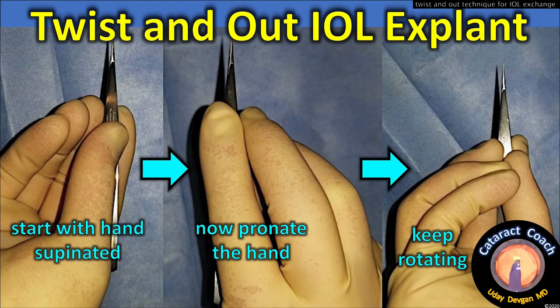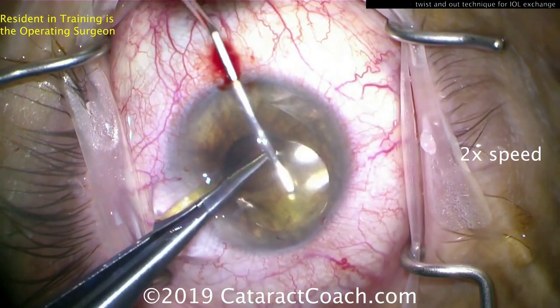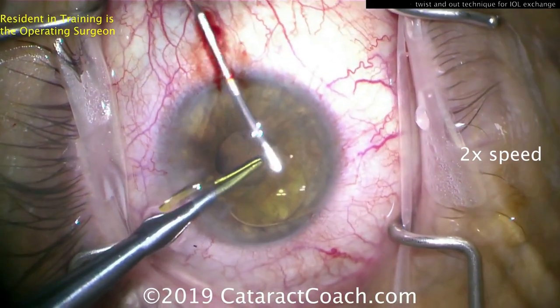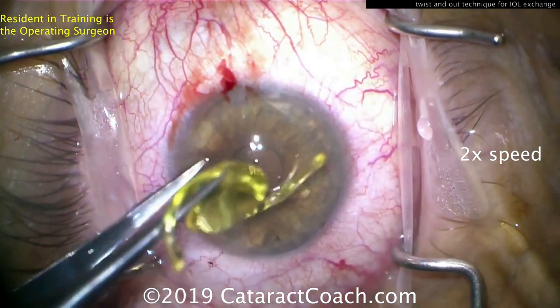The key idea is to start with the hand supinated so you can then pronate and keep rotating — that allows for the most rotation. Here's one of my resident surgeons performing this technique with only about 100 cataracts of experience, rotating the lens with tying forceps, using a spatula to roll the lens and protect the cornea, then simply pulling it out of the eye.